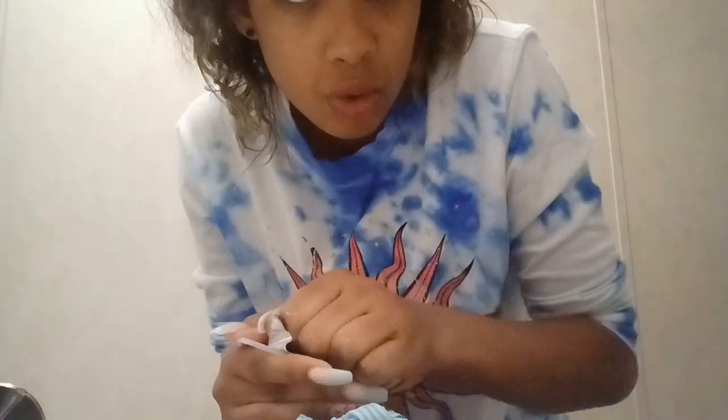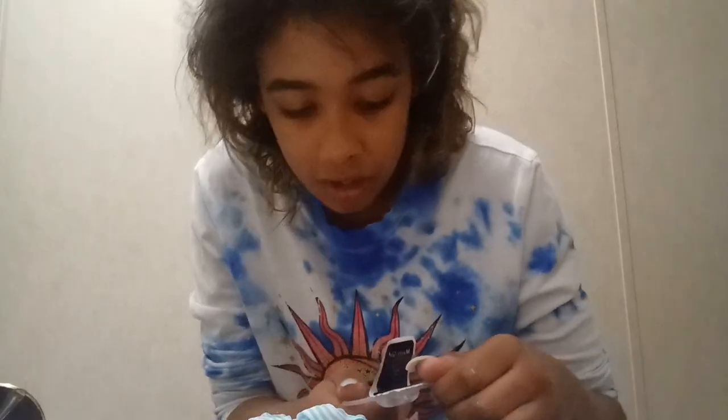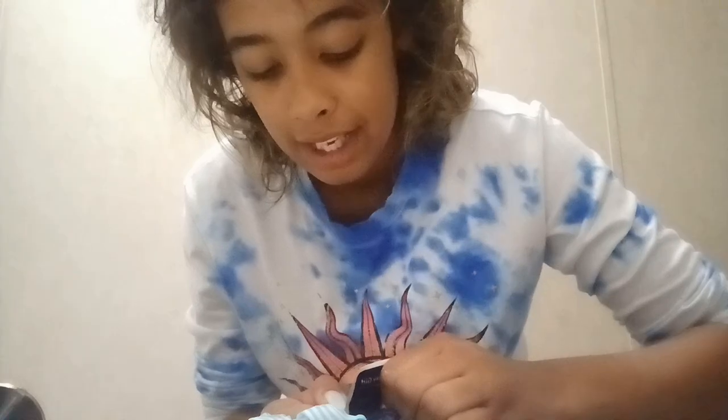These were like $24-$25, I think. I got gray contacts, by the way. I decided to get gray because — why not!